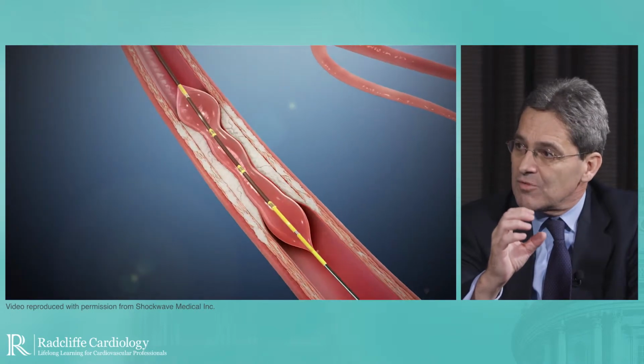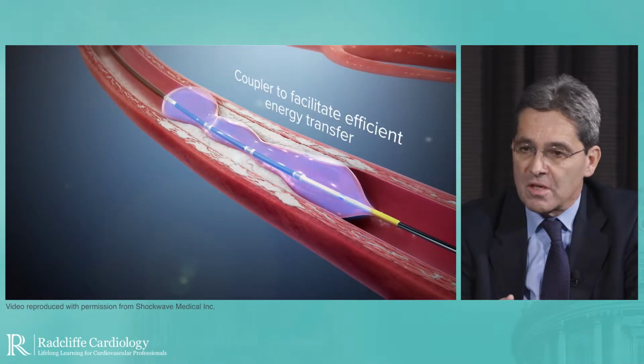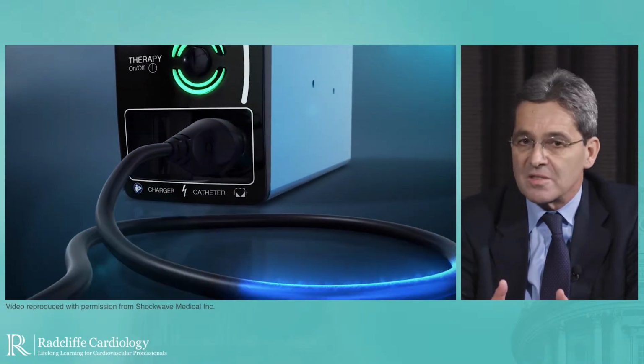It's fantastic new technology, and it's fantastic to have that in the armamentarium. It's been a long time coming. Just talk through the principle. This lithotripsy we know from kidney stones, right? It's a method to apply ultrasound remotely, in a focused beam, to disintegrate kidney stones, make them smaller so that they can go away. This principle is translated into a balloon inside the coronary artery, so you have to get a balloon in, and then aim at the calcium around the balloon, the calcium in the vessel wall. You apply shocks, the ultrasound in a sequence, and what it's supposed to do is disintegrate the calcium. It breaks the calcium bonds. It doesn't make it disappear.